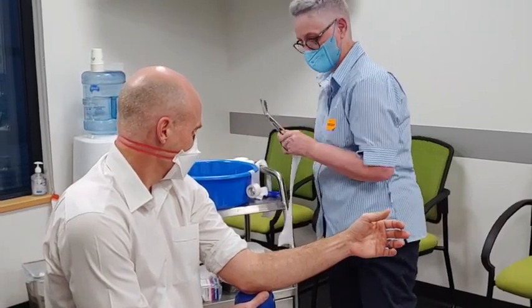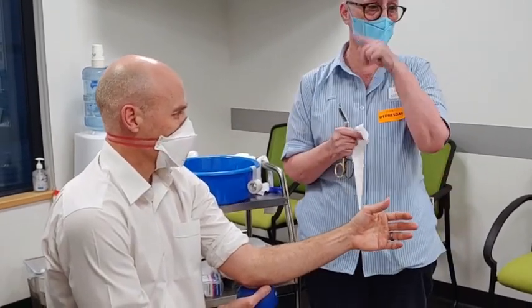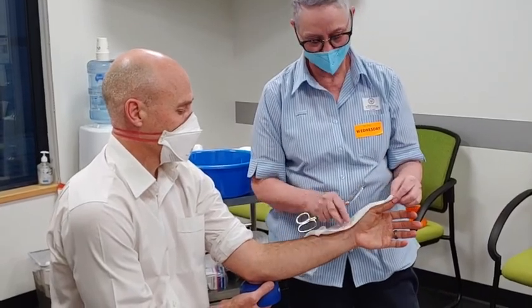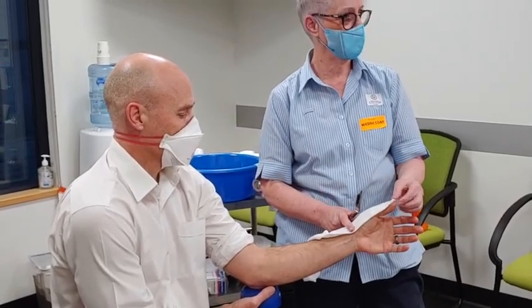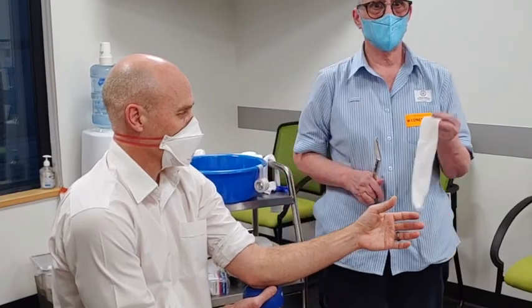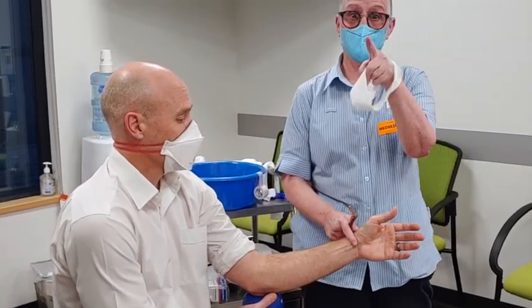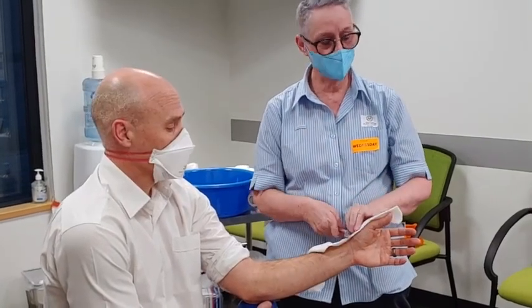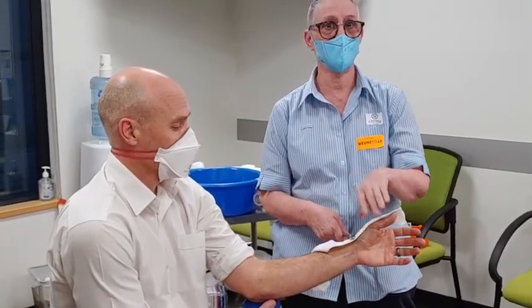Then the next piece — a step you may or may not be familiar with — we take this piece and measure from the tip of the thumb to just past the base of the thumb. That's for a scaphoid. If we were doing a Colles', we would put this over the thumb and roll it down, but we'll show that later.